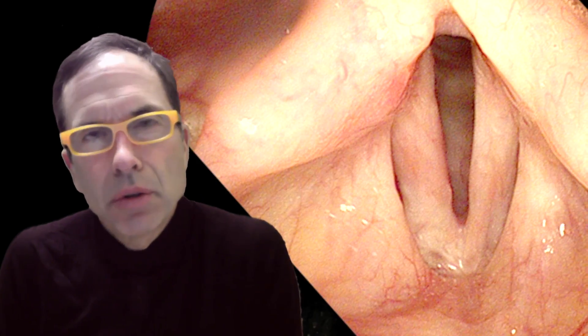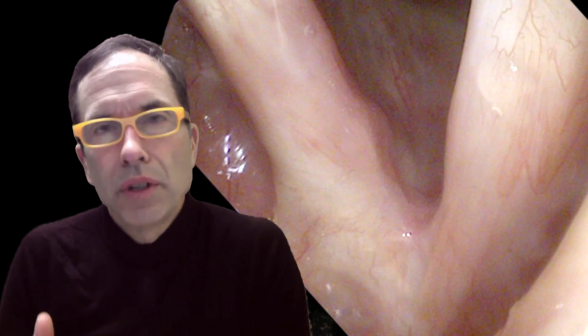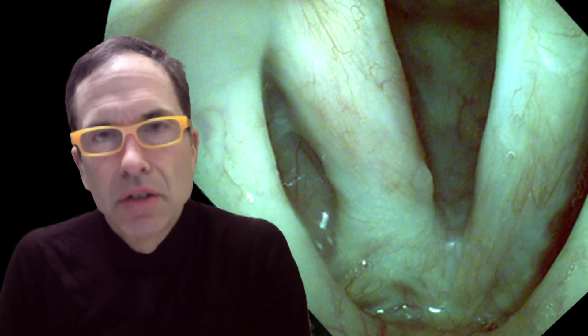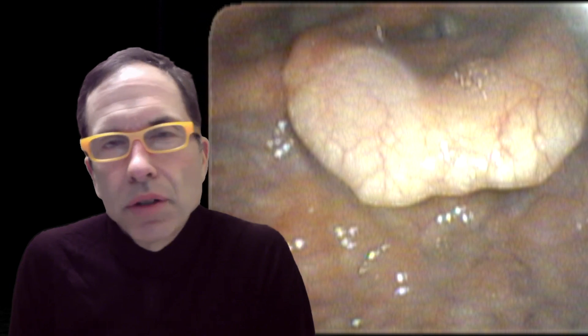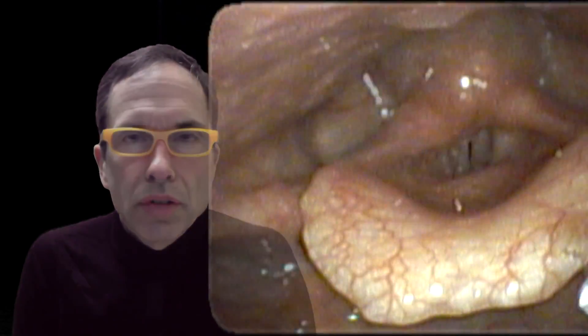Here she is at an examination about seven months after the excision. She's noted a little bit of hoarseness or change in her singing voice. Using a high definition endoscope and moving in very close, I look at an area on the right vocal cord that appears raised. I can use selective color imaging to see the detail of the vasculature and identify if this is papilloma. If it is, we have the option in the office of using a laser — in this case a KTP laser. I treat the vocal cords in the office by topically anesthetizing them, dripping 4% lidocaine onto them while the patient is phonating, creating a gargle that completely anesthetizes the vocal cords.